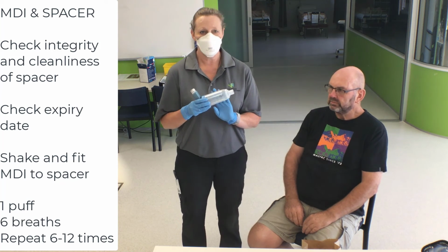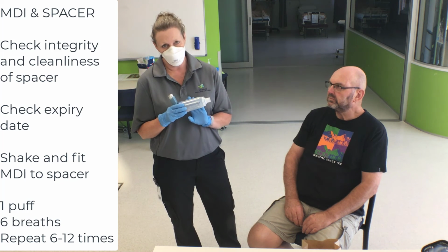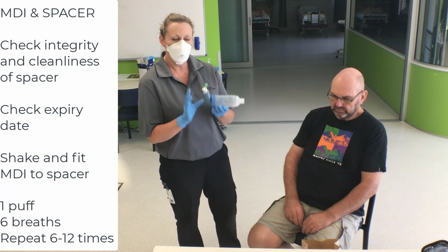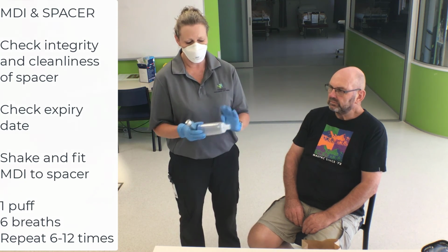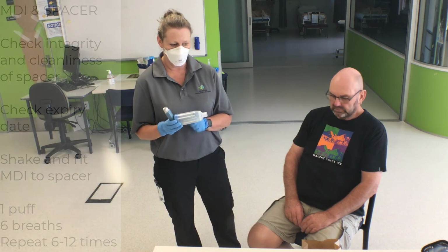Okay, we're going to do this 6 times at a minimum and up to 12 times, and the dose can be repeated. So 6 to 12 times is the dose for an MDI using a spacer in our guidelines, and it's important that we give the full amount of medication.